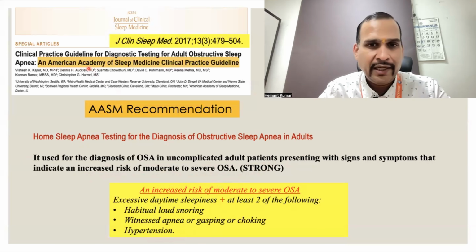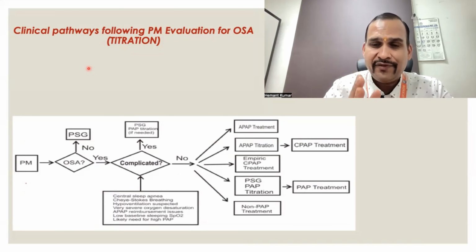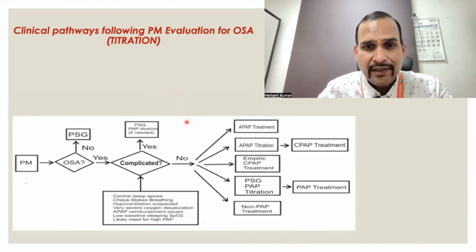So after a home-based sleep study, how to do titration? There are many ways. Either without titration, we can provide auto-PAP, or for titration, we do titration with auto-PAP.